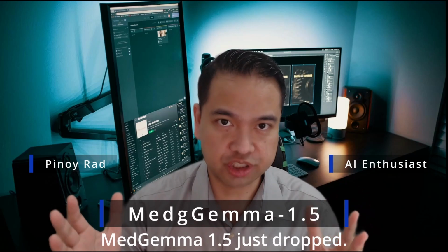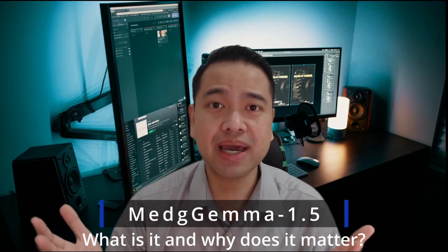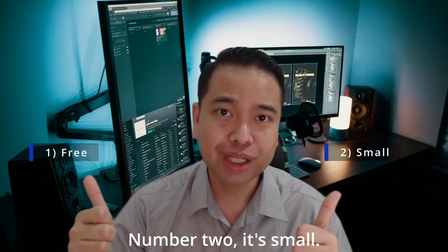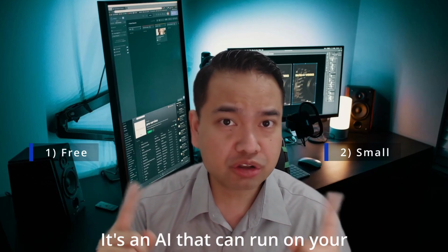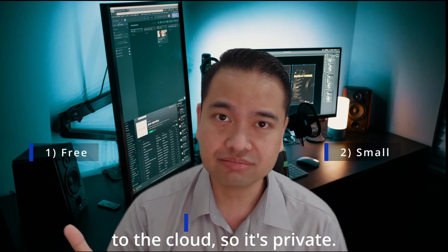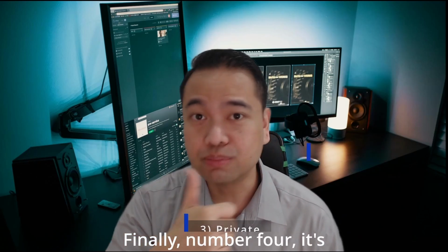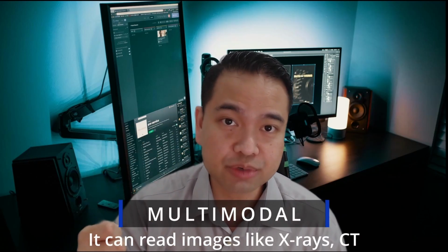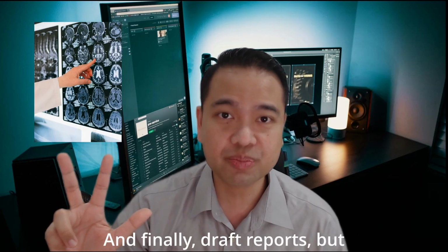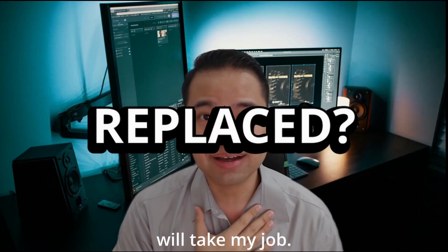MedGemma 1.5 just dropped. What is it and why does it matter? Number one, it's free. Number two, it's small. It's an AI that can run on your local computer. You don't tend to leak your data to the cloud, so it's private. Finally, number four, it's multimodal. It can read images like X-rays, CT scans, and MRIs, and finally draft reports. But will it take my job?